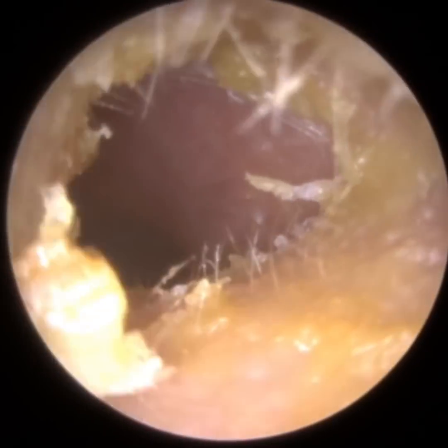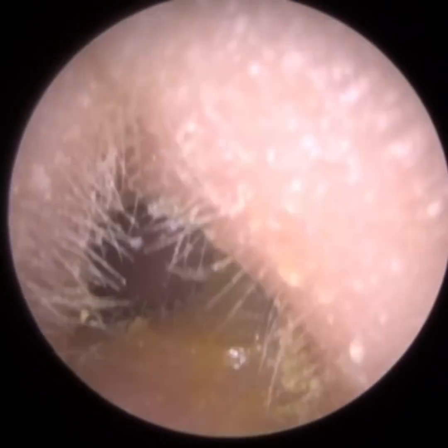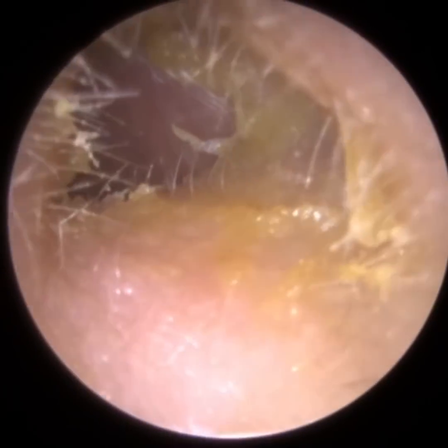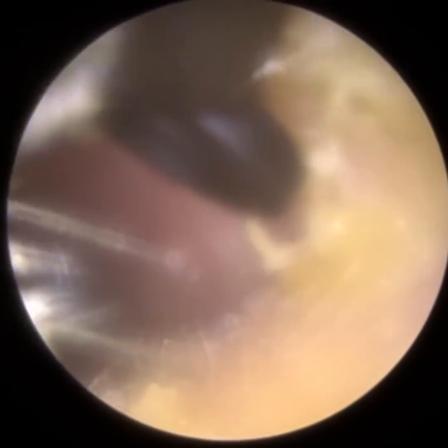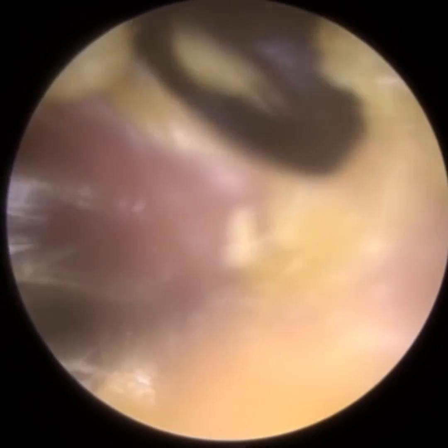It's a lot more inflamed, tender. Now, they have got medication already for their otitis externa from their ENT consultants in Singapore. So they're going to be using that after, obviously, I clean the ear. Now, I've got the debris, the main occlusion out.